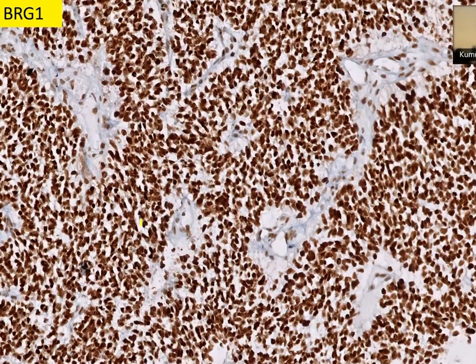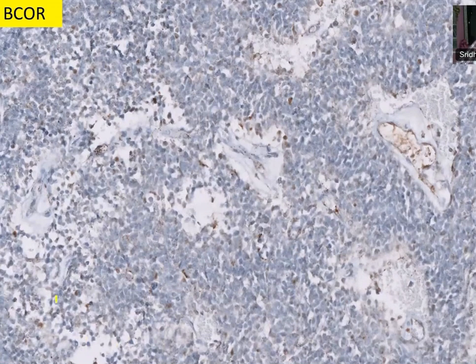Very good. So the commoner non-medulloblastoma primary tumor, ATRT, is commoner in the infantile age group, and first you need to exclude that. Here INI1 and BRG are retained, so ATRT is excluded. That brings you a picture about other spectrum of tumors. Because of the perivascular pattern, you can keep one of the differentials as poorly differentiated embryonal tumor with multilayered rosettes. You can do the Lin28, but before that, you can do other markers like BCOR, as BCOR altered tumors are also embryonal. You can see not very many cells, not a strong diffusion. So BCOR is also negative. That brings you to Lin28.